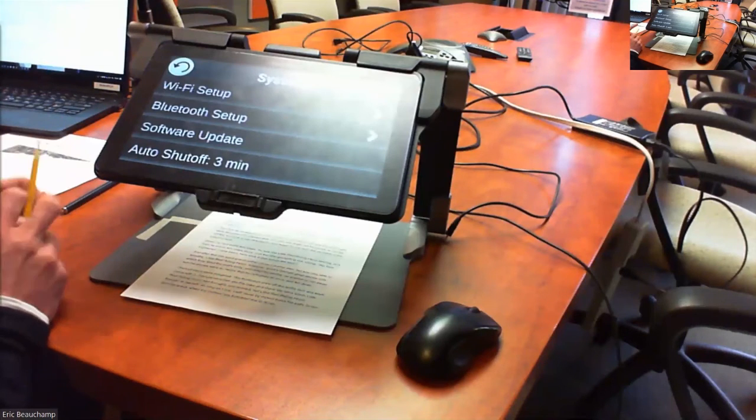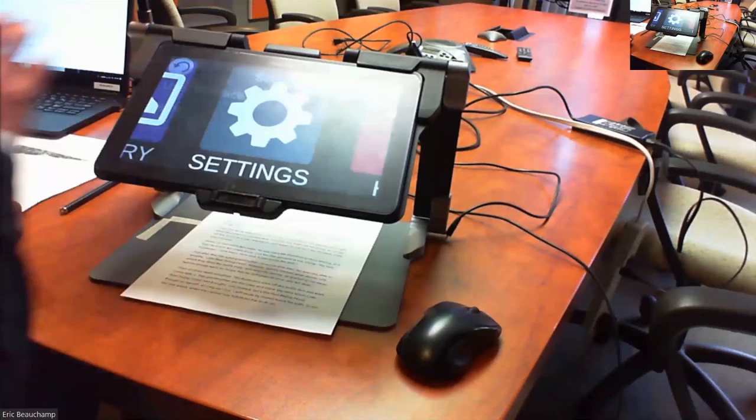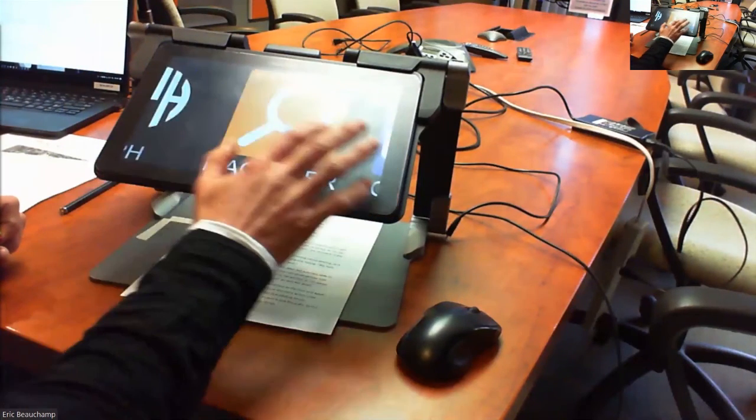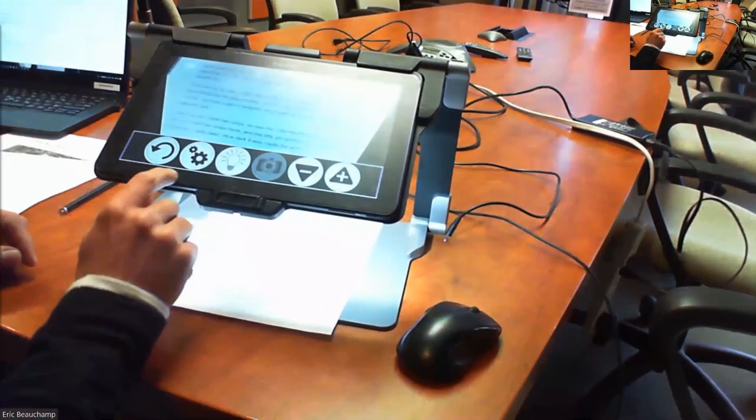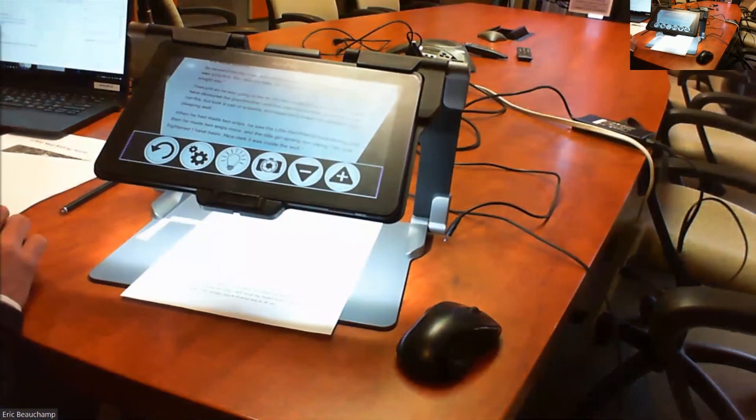We're always releasing new versions. I try to have at least two versions per year, always coming out with new features, and the next one will be in March, and I'll be addressing a lot of the really low vision students. Students that have really low vision have problems with reading or knowing which button to press. In Prodigy, TalkBack doesn't work fully, but we've created our own TalkBack into Prodigy so that the very low vision student can start using the Mat Connect and go through all the buttons. So that's one of the features that we're going to be coming out with in March.